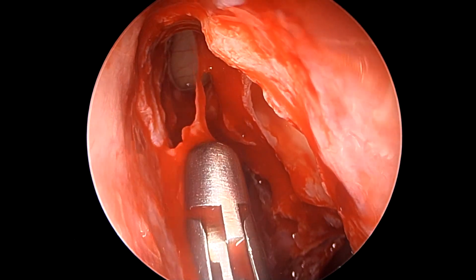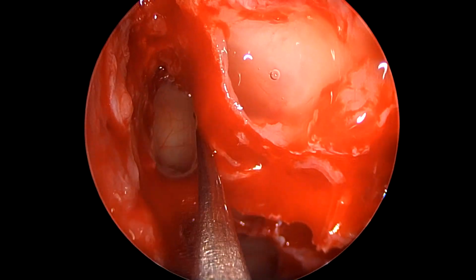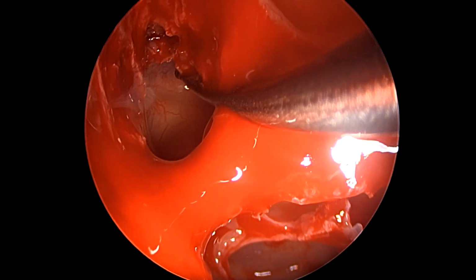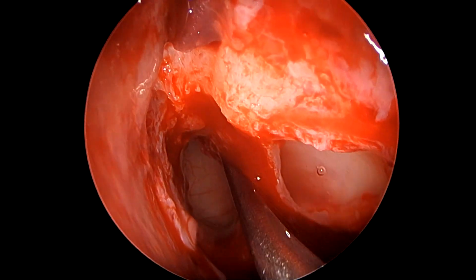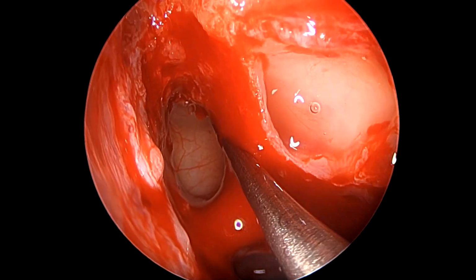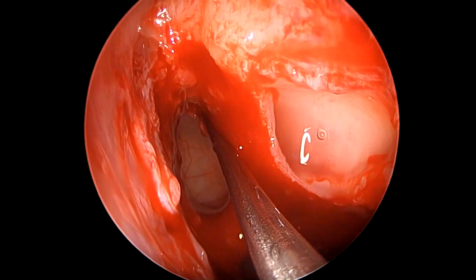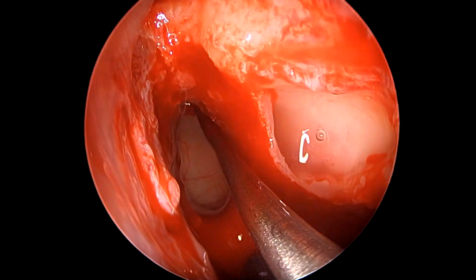So once again, you can see how important it is to have a clear understanding of the anatomy of the frontal recess and use multiple instruments. We began with a thin frontal sinus probe, and you can see here now with the 70-degree camera, this is the wall we are talking about. This is the anterior wall of the suprabullar cell that was restricting the access into the frontal sinus. Now we are just behind the frontal beak and in front of the anterior wall of the suprabullar cell, and this is where the location of the frontal sinus is, as you can see here.